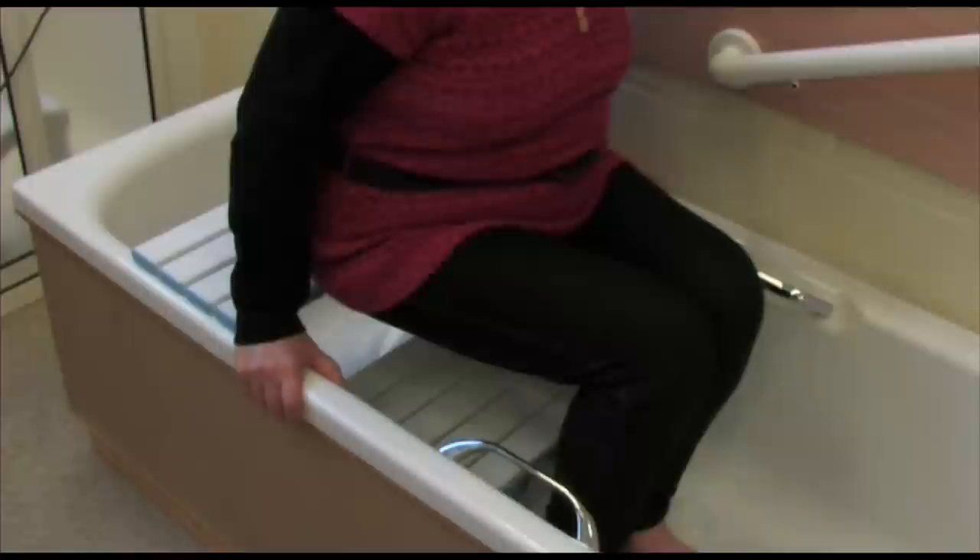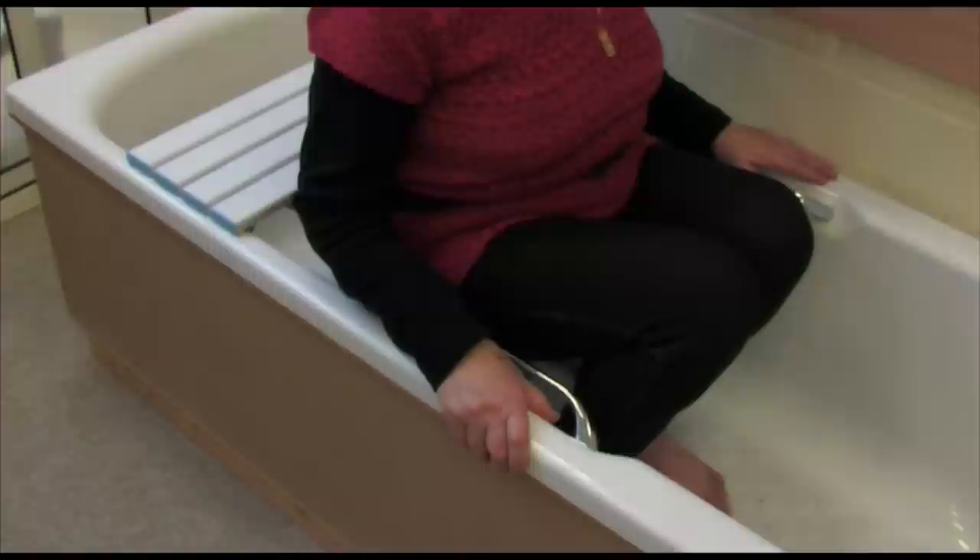Place your hands on the side of the bath and gently lower yourself from the board to the seat. You can now wash.